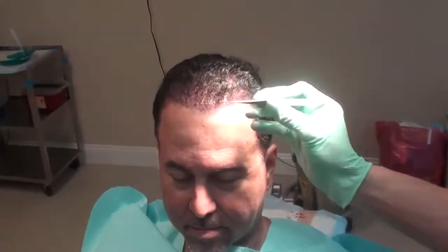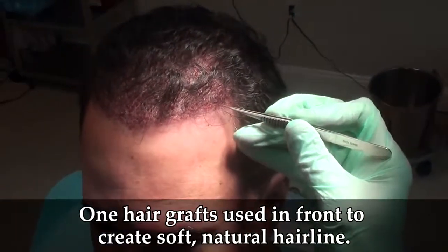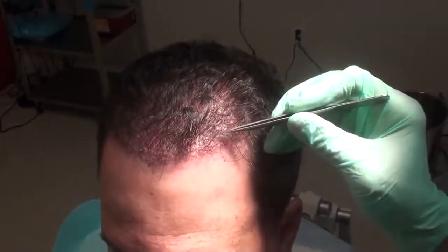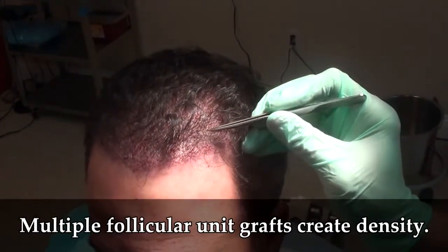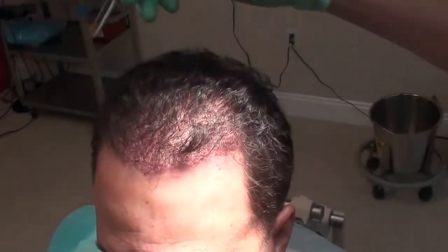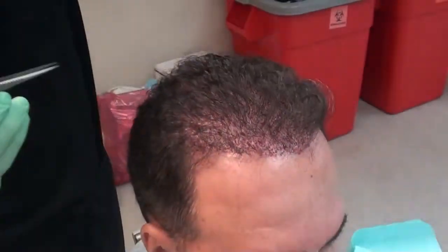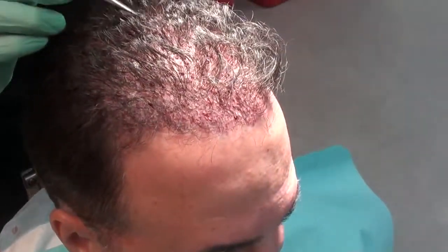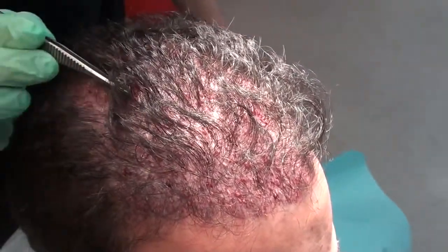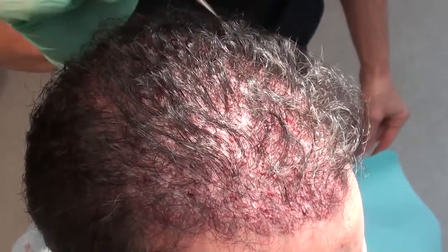We completely restored Jay's hairline with all the little tiny 1 hair grafts all the way around the front. Little 2-3 hair grafts back there. And then all the way back here we have those multiple follicular unit grafts, which create the density. So we went in between all the way through, blending in between where we were before. Then we went through, filled in this top area, blended all the way in through the sides over here, so you can see the grafts all the way through over here.